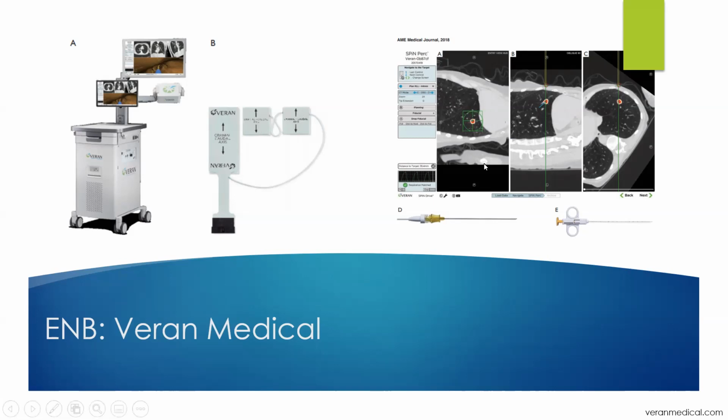What you see in the top right is how that transthoracic biopsy is performed. You'll have your lesion here in red, and these are various angles of cuts. When your tool is lined up properly, these crosshairs will turn green to say that you're on the right trajectory to get your biopsy. You'll stick in this needle that has an inner stylet. Once you get into your lesion, you pull the stylet out, and then you can insert various other types of needles to get your biopsy.